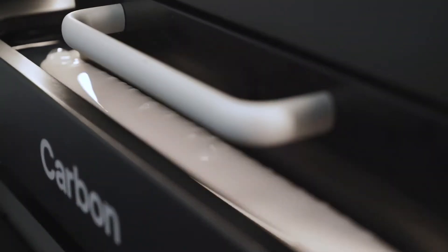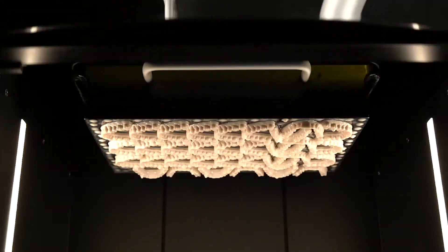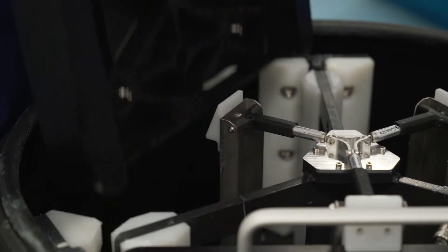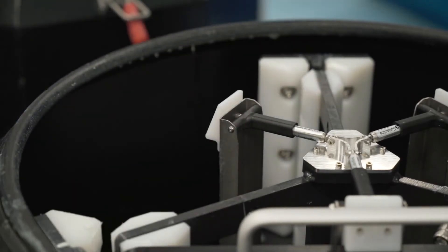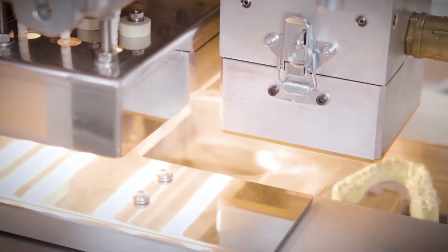The design is sent to the carbon model printers for production. After the arches have been printed and have undergone post-process cleaning and initial QC, the models are placed in the thermoforming unit.